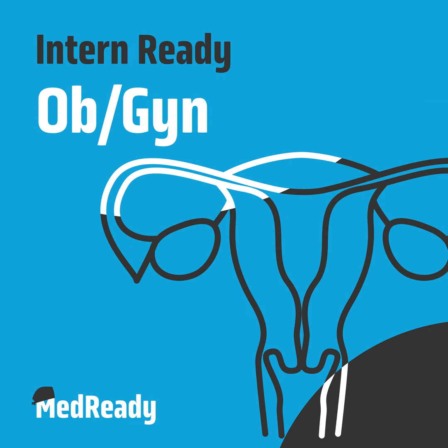The other parts of the hysteroscope include an outer sheath that houses the telescope, and an inflow and outflow port. So the inflow port is where the fluid delivery system, usually normal saline, will drain into the hysteroscope, and then the outflow port is obviously where it comes back out.